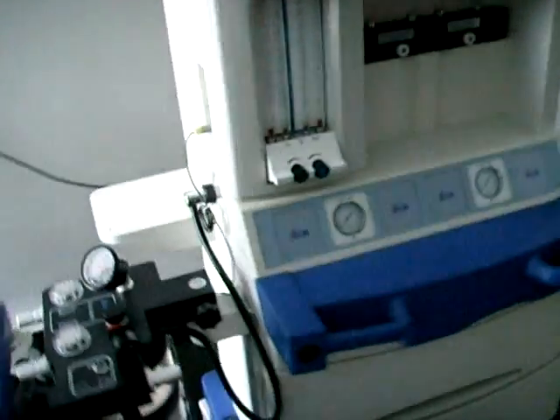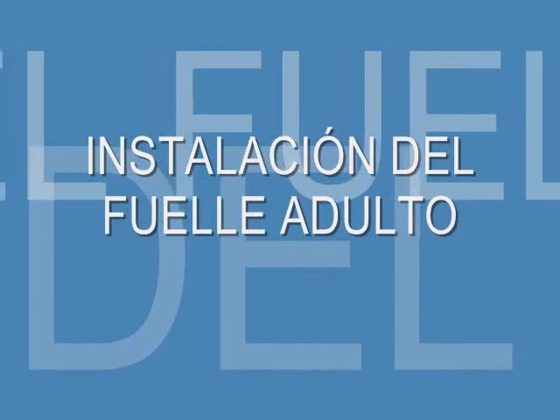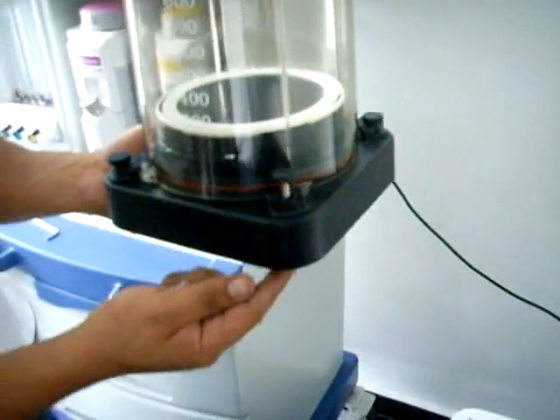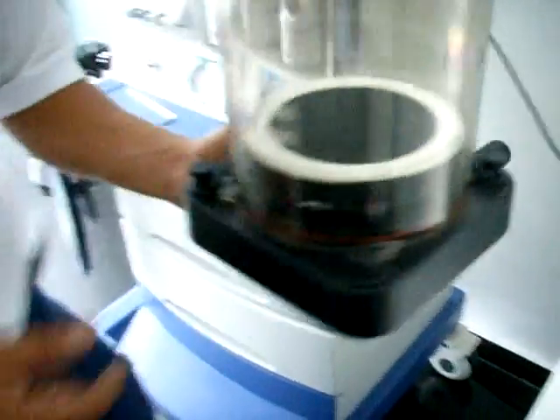Esta es la forma como realizamos la instalación del soporte de fuelle adulto. Para la instalación del fuelle adulto identificamos las cuatro tuercas que serán el soporte y el ajuste del fuelle adulto. Identificamos también los cuatro orificios sobre la base del fuelle, los cuales tendrán la posibilidad de ajustarlo.